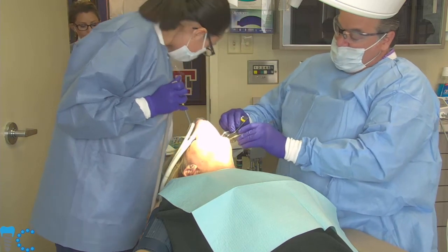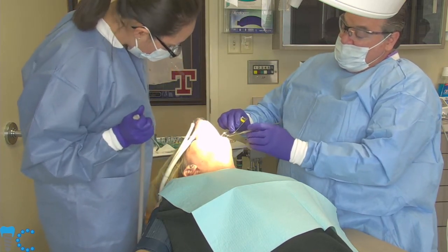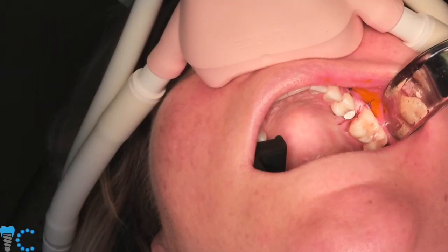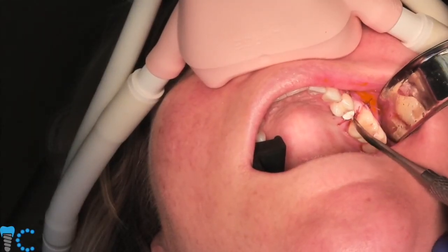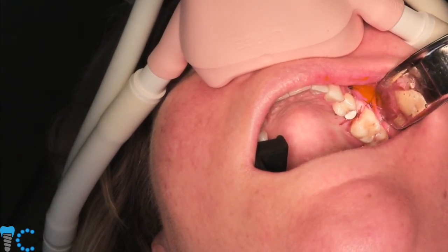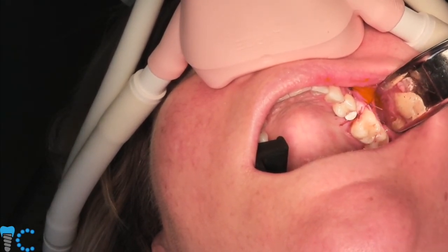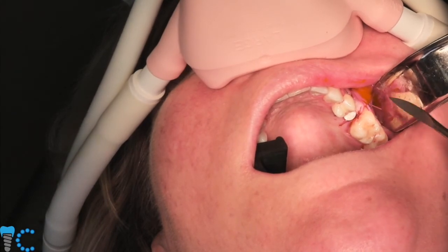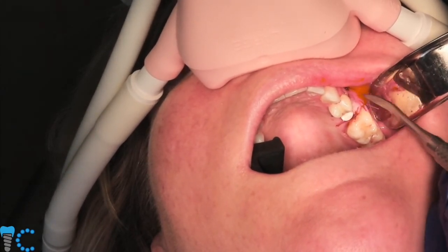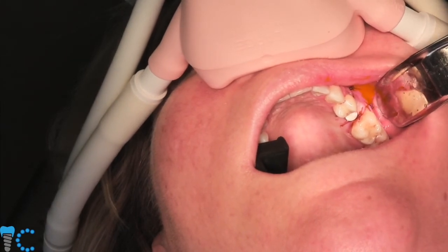There's our final implant placement right there. And what I think is important to notice, our placement's spot on. We're using the healing cap here to help keep our soft tissues retracted. And if you look on the buccal, the thing that makes me happiest of all about the surgery is look at this attached tissue on the buccal. All this tissue here came from the ridge crest.